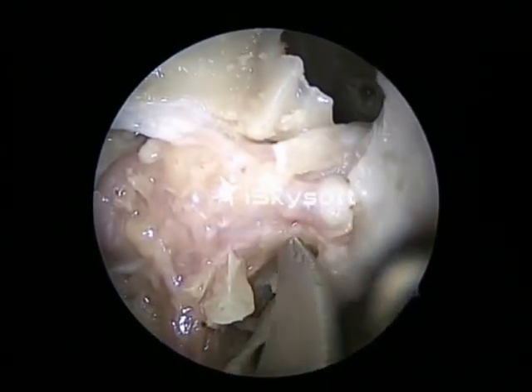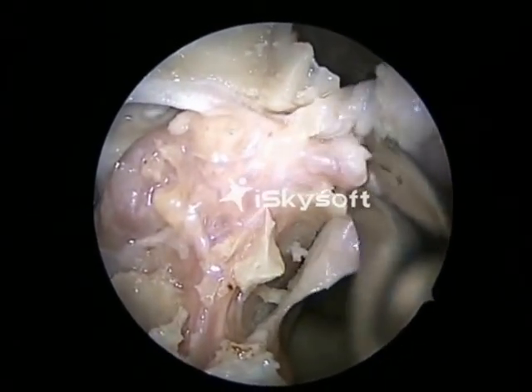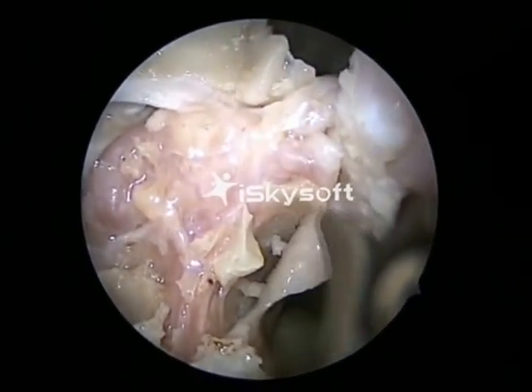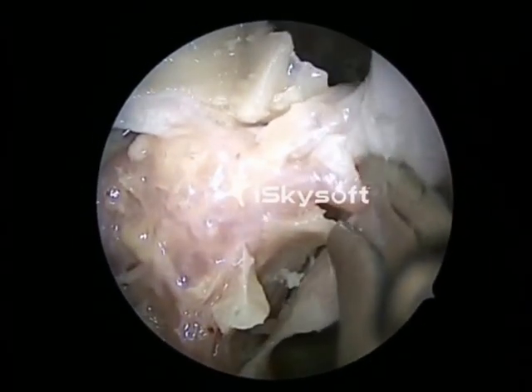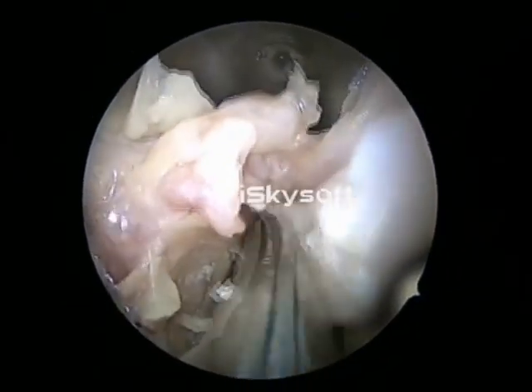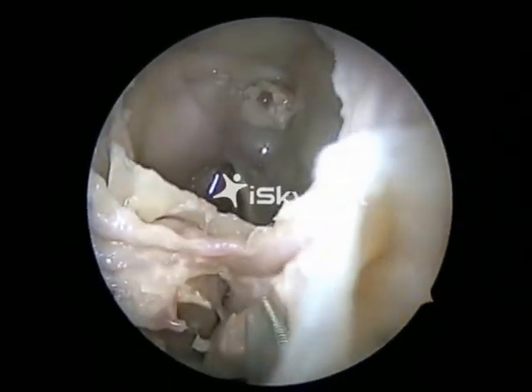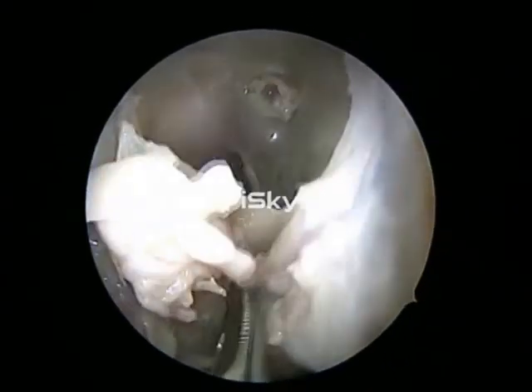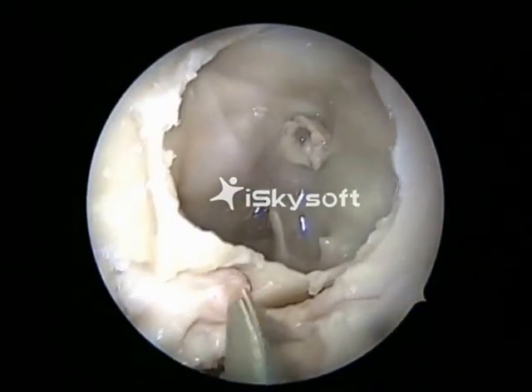And once the dissection of the pterygopalatine fossa is completed, we move on to the next exercise, locating the Vidian nerve. We either cauterize or clip the sphenopalatine artery, and then once we do that, we will have a look directly onto the Vidian nerve, which comes out of the Vidian canal.